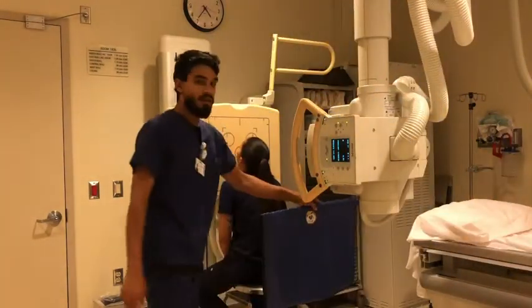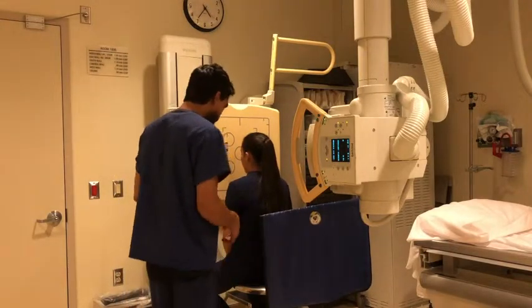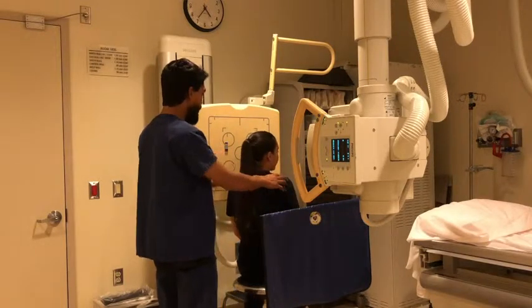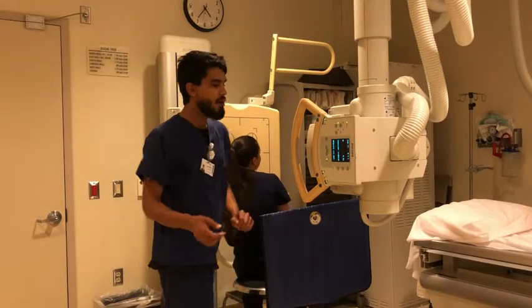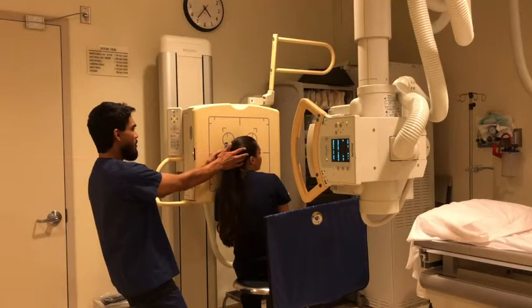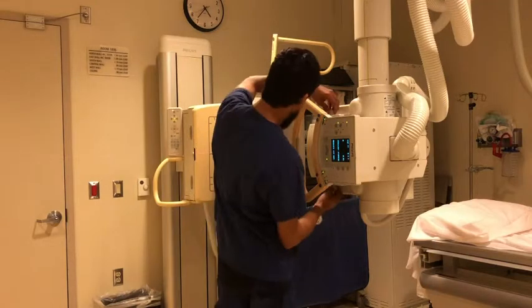Okay, so now we're going to be shooting a lateral image. So I'm going to have my patient turn to her right side, not all the way, a little bit of an oblique position so that she can get her face nice and close to the IR. I want to make sure there's no rotation, so I'm going to move you this way a little bit. Good.